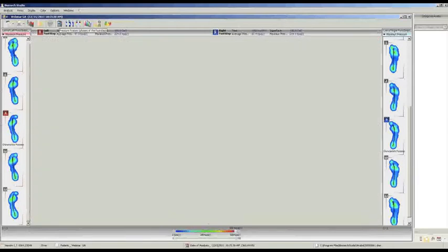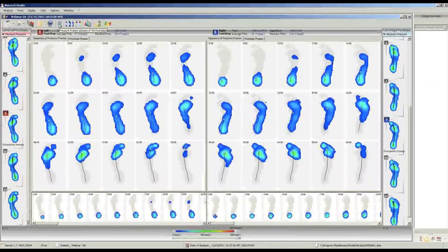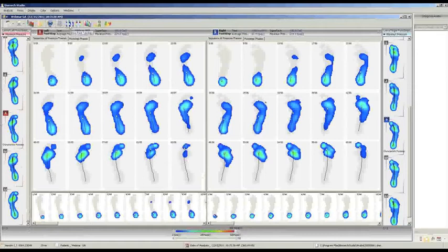Here is another visualization — it's the fourth one — where for each footprint we can see frame by frame what we saw in the section before. It's like the movie we saw before, but done frame by frame. As you can see, we start with the heel contact, we go into overload — first the external part of the foot, then the internal — and then at the end we have the disconnection from the surface with the toe off.